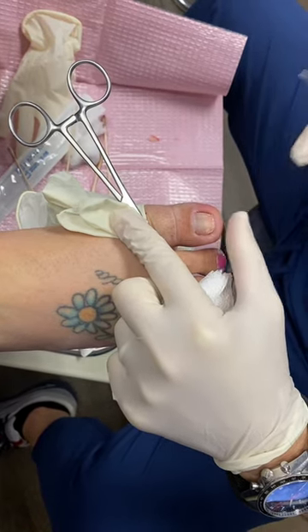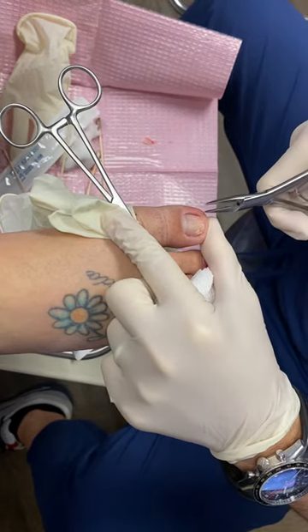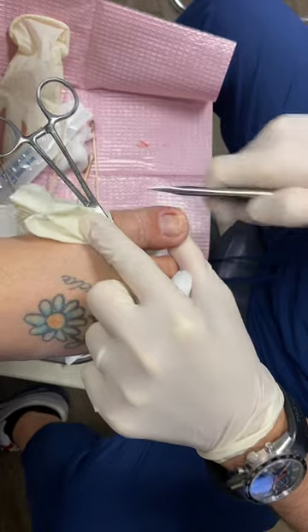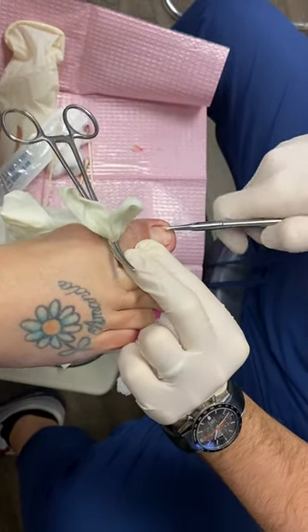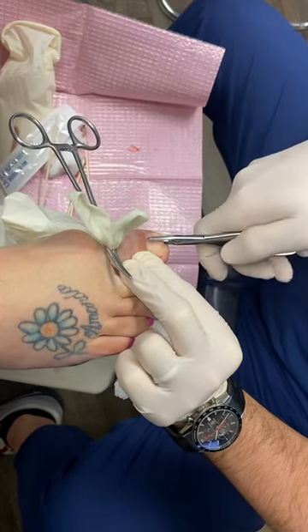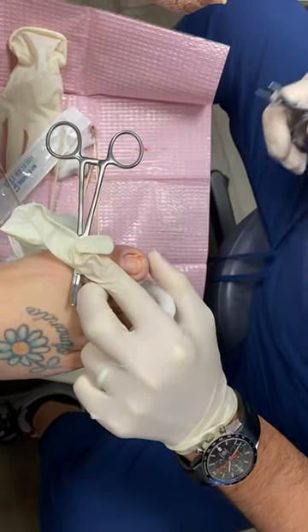Once it's out, we can't put it back. So we're going to start by using an instrument called an English Anvil Nail Nipper, and we're going to come under the side of the nail, beneath the nail like this, and we're going to slide the instrument back and wiggle it a little bit.